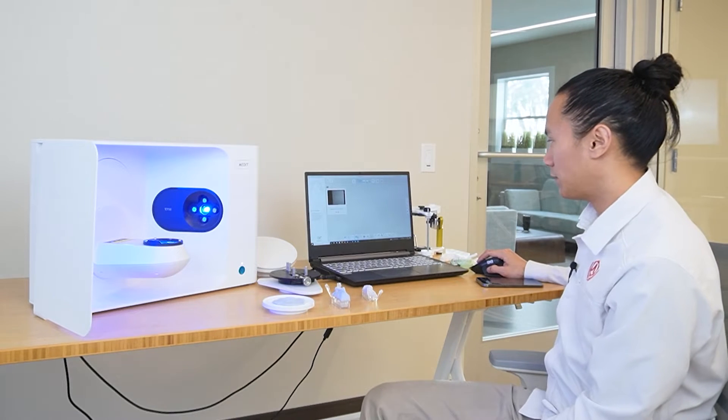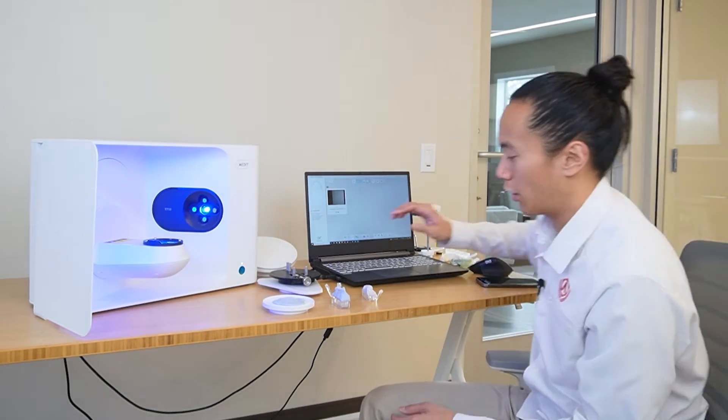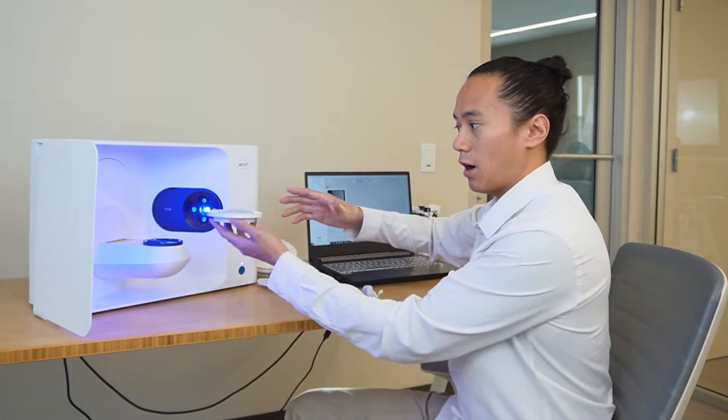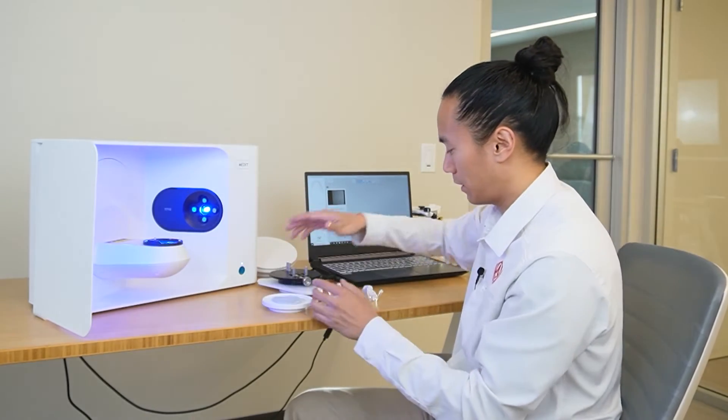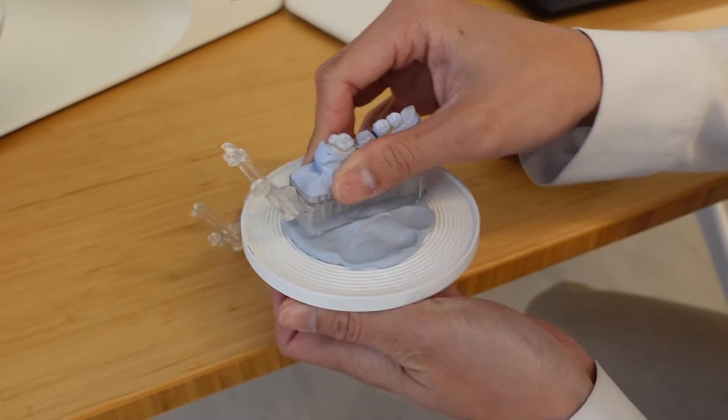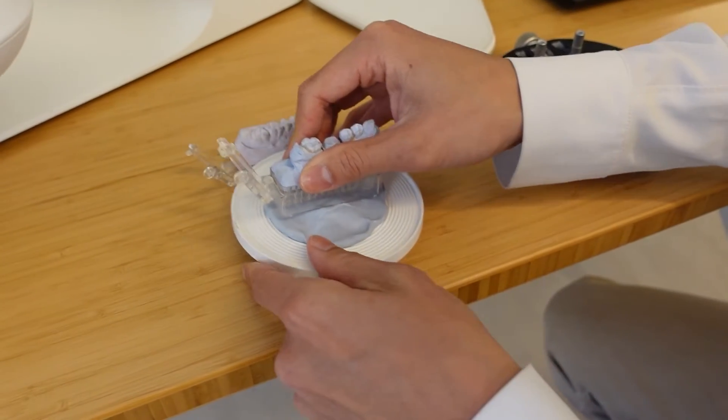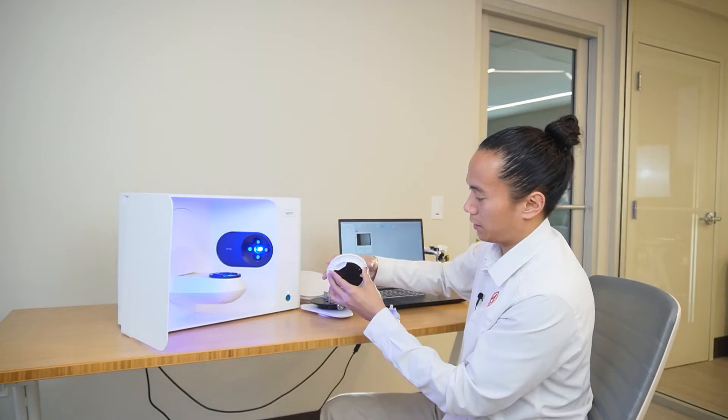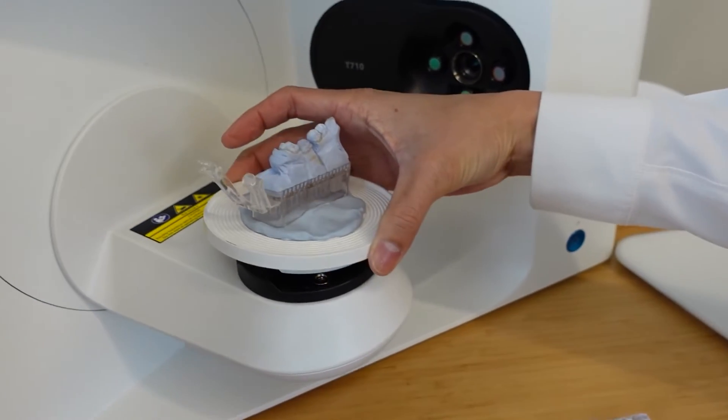The first step here is to scan our opposing. And again, I have my plate off of my scanning arm. I'm going to then just take my opposing model and we're just going to fix it onto our plate. Double check that it's stable. And from there, place it onto the scan stage.